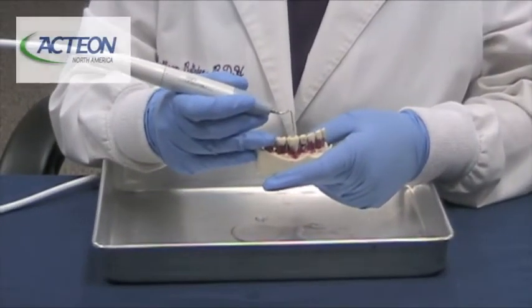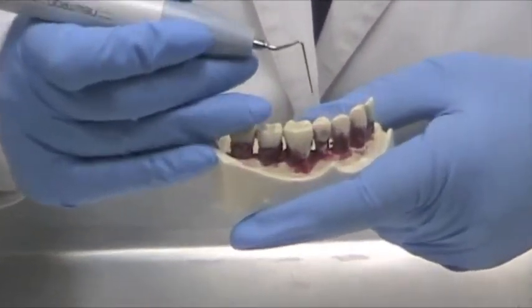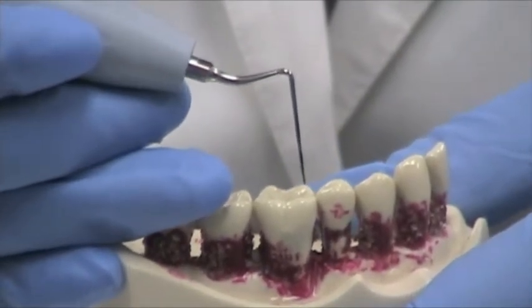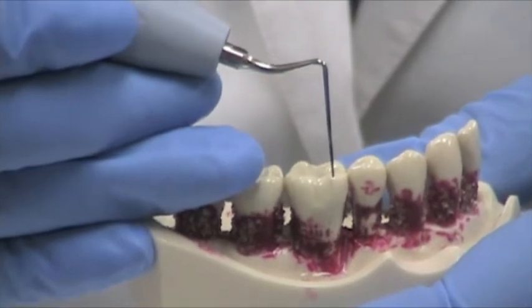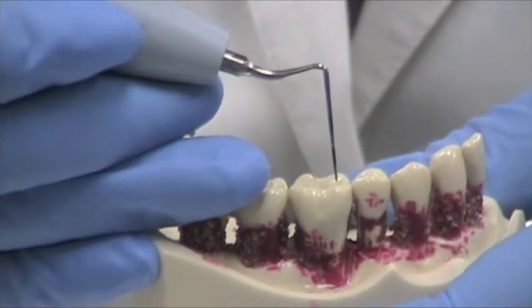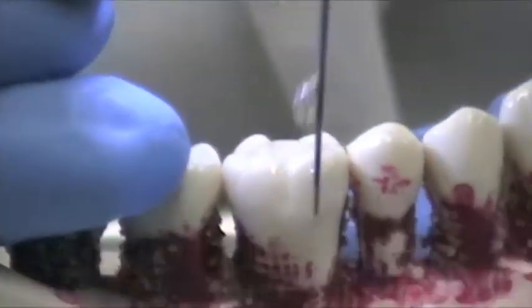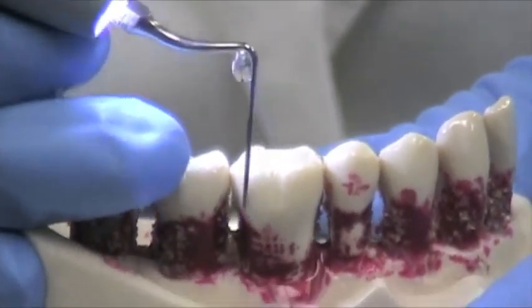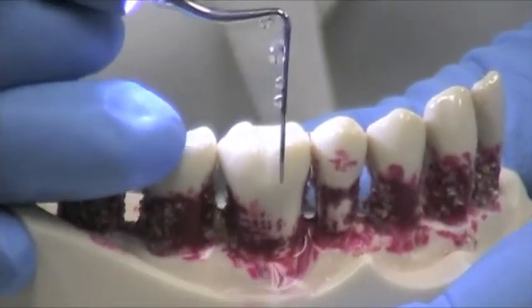Now we're going to demonstrate the TK-1-1L. You can see this — it's not a probe, but it looks just like a probe. This insert is for periodontal pockets that are deeper, going to 5, 6, 7mm. You can see the calibrations are marked exactly like the short perioprobe: 3, 6, 9, and 12. Same indications as for our other tip.